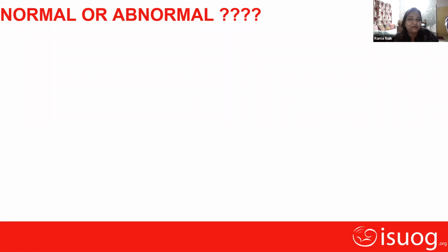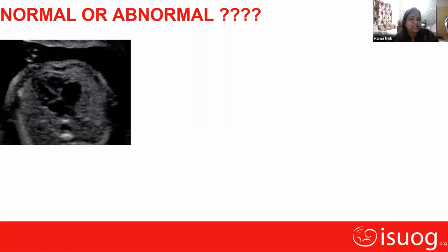So I'm at the end of the session with the most exciting part. Everyone has to unmute and please participate. You have to give your feedback, what you feel. The first image, is it normal or abnormal? Normal. Yes, sir. Normal. So thank you. So this is the normal plane 7 picture where we can see the heart, the lung.